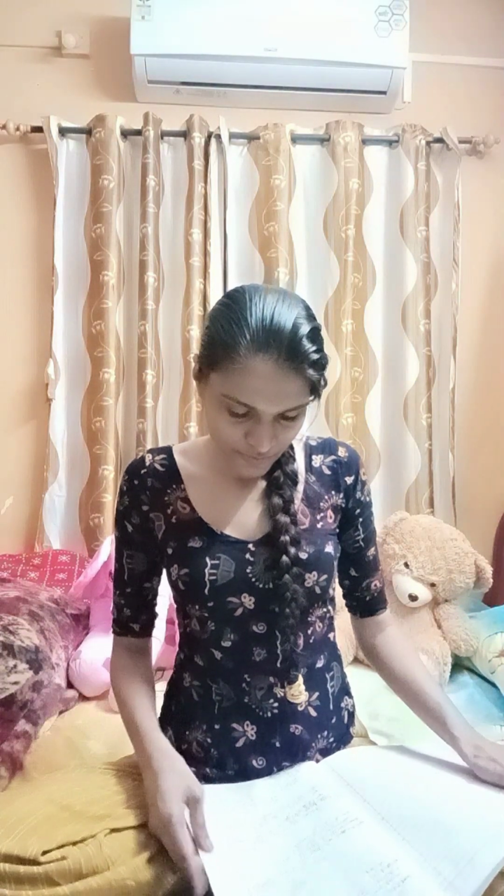Now interpretation, how to interpret this chart. Either there is a paralytic squint or restrictive squint. Paralytic squint means nerve palsies, and it can be comitant or incomitant. Comitant means deviation is similar in all gazes, and incomitant means deviation is not similar in all gazes. So paralytic squint can be incomitant and comitant. Incomitant in the early acute onset phase, and in late onset phase it becomes comitant.